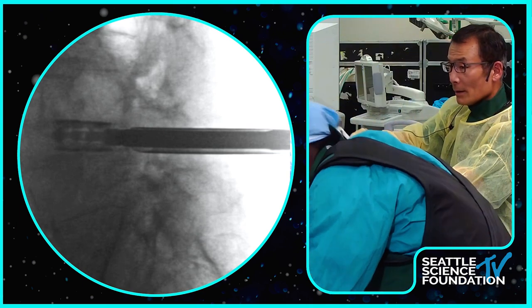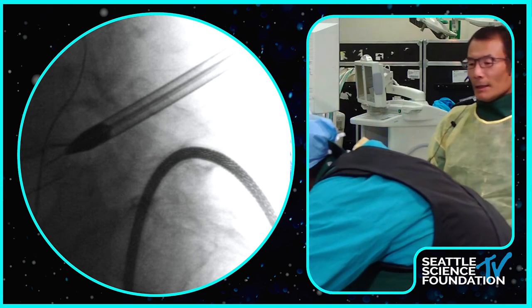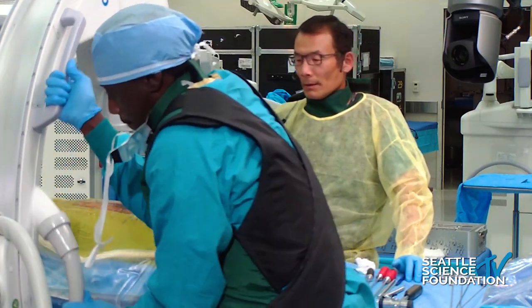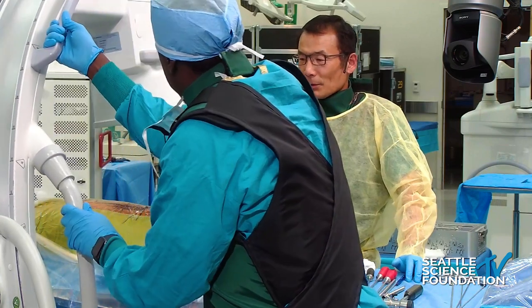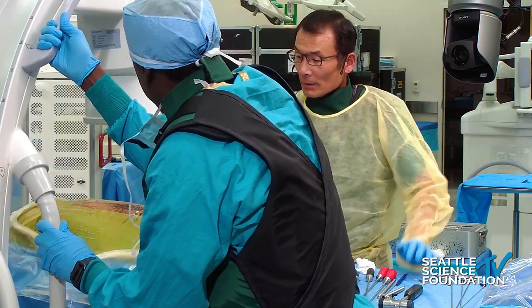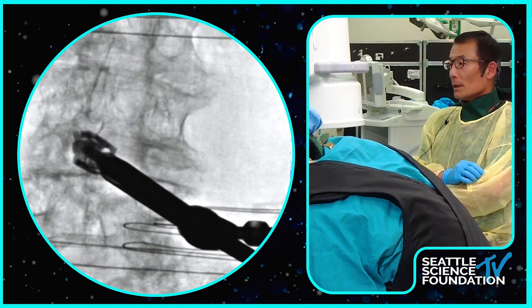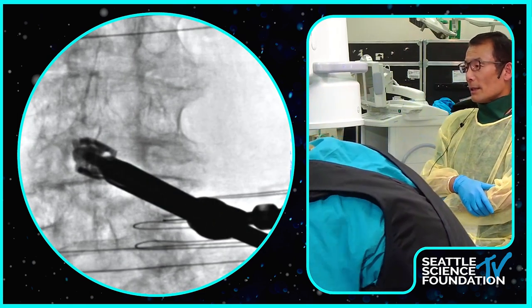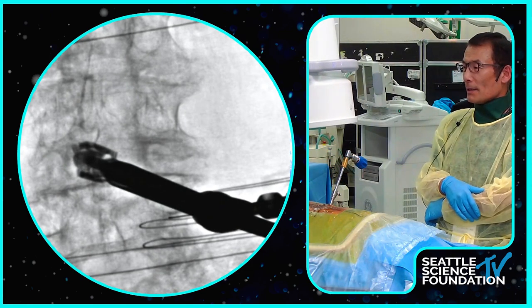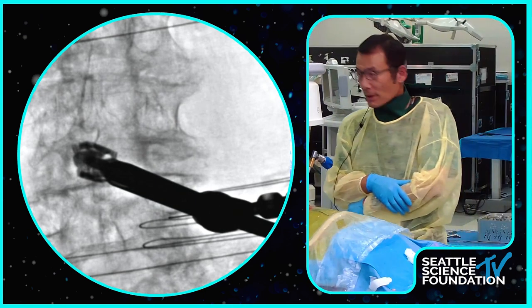And do you typically use two of these implants or one? You can. But one on each side, or just one? Do it. But usually, I just use one. That's good. Pull back towards you. Pull back towards you. Pull back towards you. Okay. Take a shot there. Yeah, you can see that it's pretty good, okay? It's not a perfect AP, the end plate, but medial lateral wise, you're pretty good there, okay?